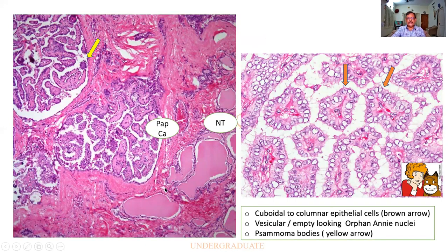If you are getting this in your exam, you are lucky with the slide. So there is a normal thyroid with the follicles, thyroid parenchyma, whereas this is a papillary carcinoma. These are all cut surfaces of the papillae. And in some areas, there are bluish areas, homogeneous and dark, which are areas of calcification called psammoma body. So these things, people can be able to describe it very clearly. And these are all the cut surfaces, as though you have cut your fingers. It appears exactly like that.